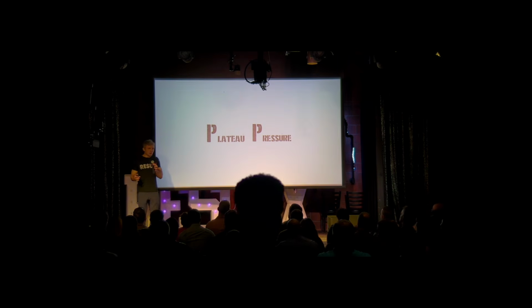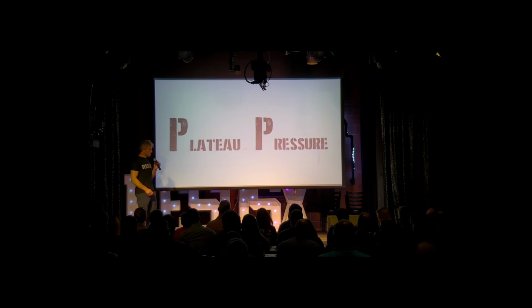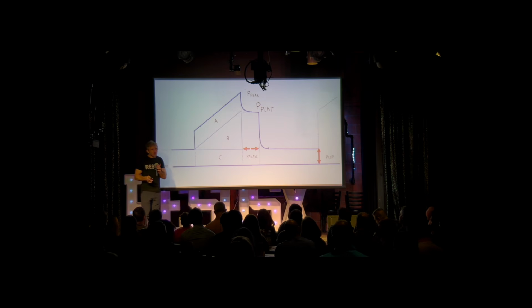And what typically we're taught to check our work is the plateau pressure, right? And it's a fairly simple maneuver, which essentially what we're going to do is conduct inspiratory pause. And so at end inspiration, vent pauses and gives you a static pressure, right? And when you ask someone, what is the plateau pressure? What you usually get back, it's the static compliance in the lung, right? You guys have all heard that. And that's mostly complicated, hard to understand, and it's really hard to know what that actually means.